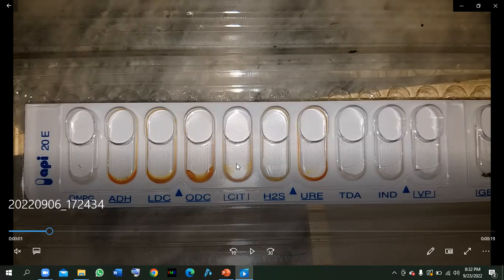No immersion oil is added. So keep these points in your mind when you see this type of line. Half of the well is filled with your inoculum, and the remaining portion is filled with immersion oil, to give the chemical reaction an anaerobic environment, because oxygen can disrupt our chemical reaction.